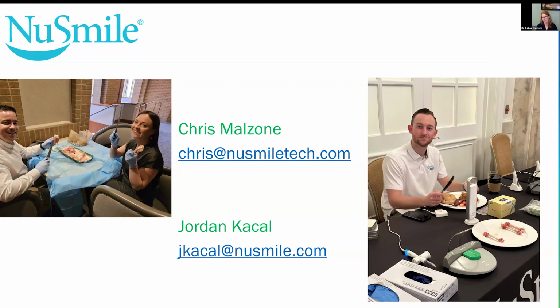Yes. Okay. So drive is like you drive your car. You step on the pedal and it goes. And by the way, this is only with the Soan. The SleeperOne 5 does not have these options. The cruise mode with the Soan means you tap it once and it's just going to go. And one of two things happen: either you tap it again, or you finish the carpule, it pressurizes itself and self retracts.